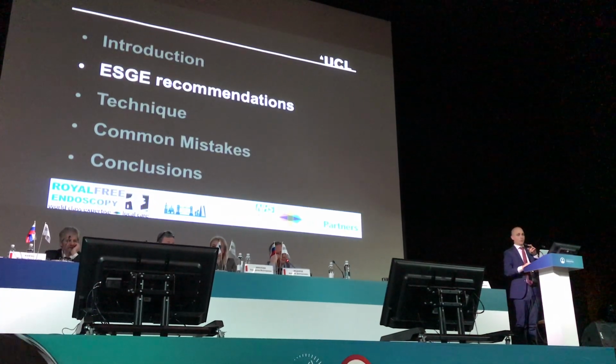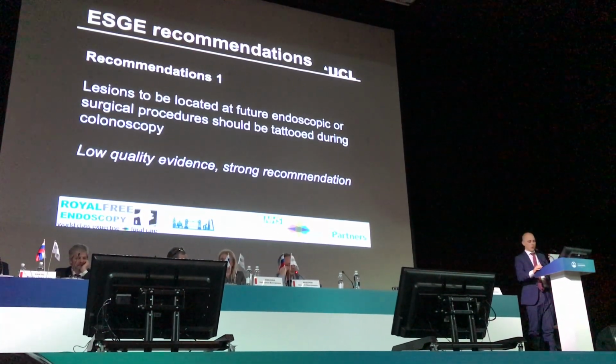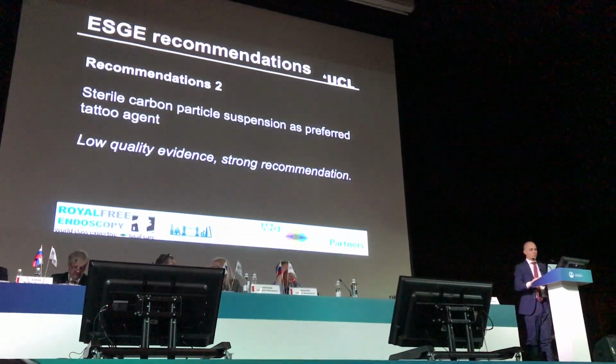So now let's talk about the ESGE recommendation. There are 4 recommendations. The first one, as we said, is that we tattoo close to the lesion to find the lesion for follow-up or send them to surgery.